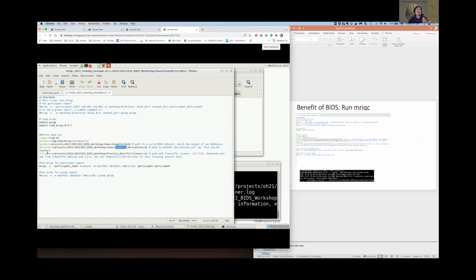And then the last thing is you need a license. So for now, you don't need to worry about it. You can just borrow the license we have for the hands-on sessions, but eventually you'll get your own. And then there's just one line of code here, if you can read it clearly. So this is mriqc, -v is for verbose. Just print everything onto the screen, and then tell it exactly which participant you're going to run. So in this case, subject 01.